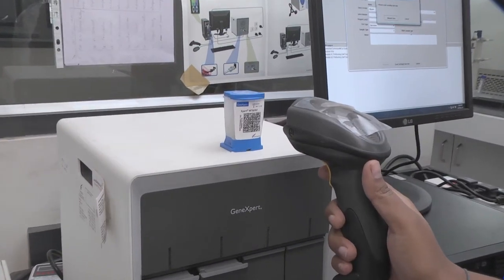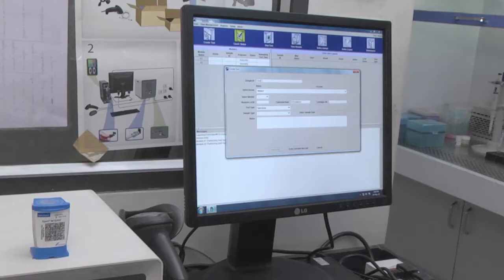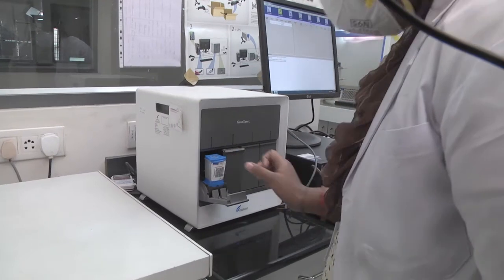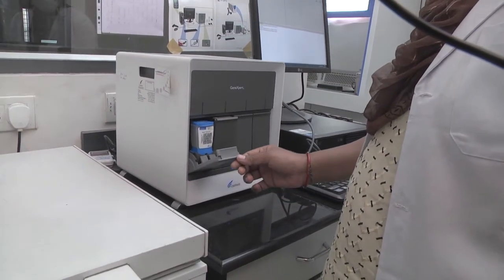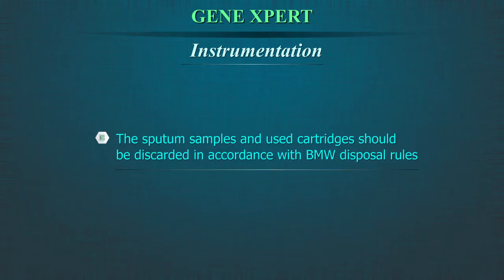Scan the barcode on the cartridge with the barcode reader. This automatically feeds the lab identification number into the attached computer. Place the cartridge carefully in one of the slots of the GeneXpert. The results can be obtained within two hours of feeding the sample. The sputum samples and used cartridges should be discarded in accordance with biomedical waste disposal rules.